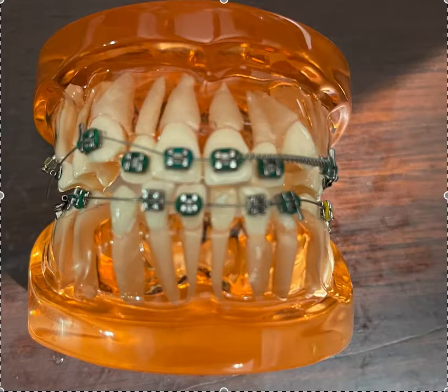So it's nothing I can demo that you would notice with your naked eye. It's really just down to how things handle. I find more orthodontists use 018, more DSOs use 022, more GP dentists use 022, but that doesn't mean one's wrong or right. So I'll tell you the differences, what I notice, and you can pick your own personal preference.